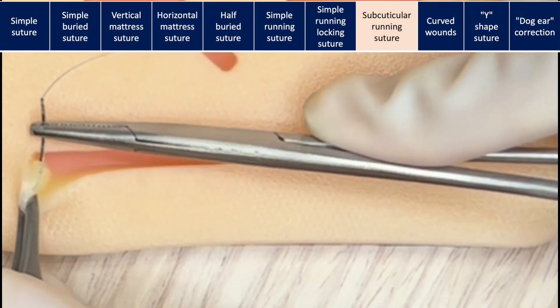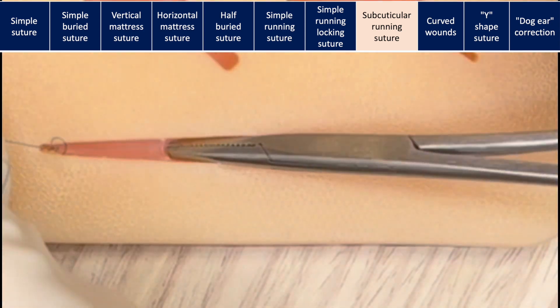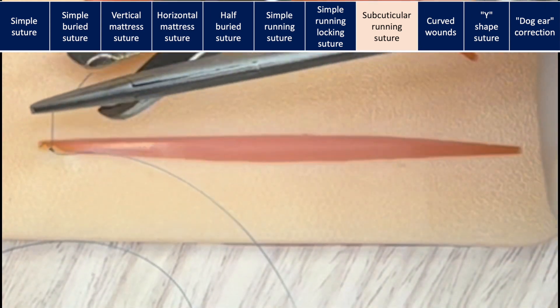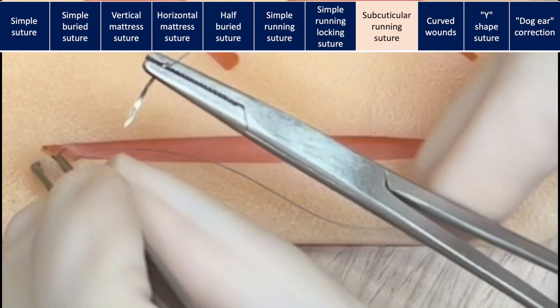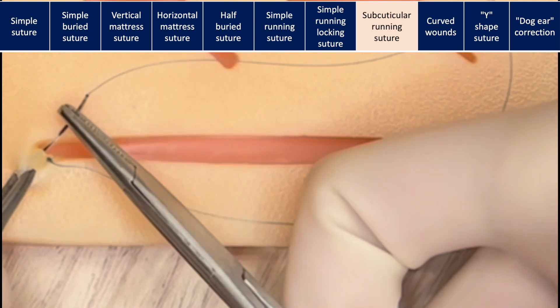This is the subcuticular running suture. If you use an absorbable suture, you can start by burying the knot. You will go deep in the corner, away from the skin, and do your instrument tie. This allows the knot to be buried. With the knot deep, you're going to go deep and then superficial — that brings us right up to the corner, and this is where we're going to start our suture.